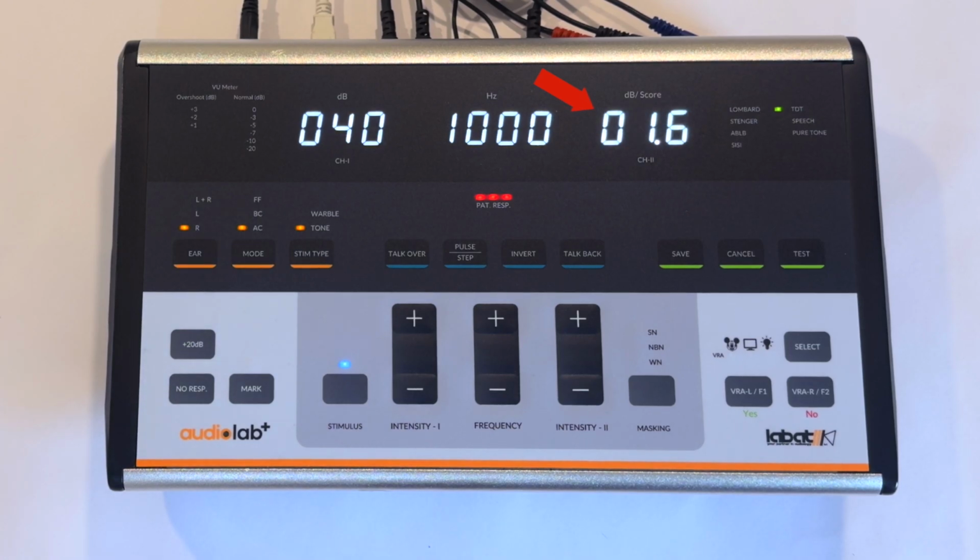If the switch is held for less than 60 seconds, the stimulus will increase by 5 decibels. If the patient holds the switch continuously for 60 seconds, the response is considered sustained and the stimulus will turn off automatically. Change the frequency and adjust the intensity as required to evaluate all desired frequencies.